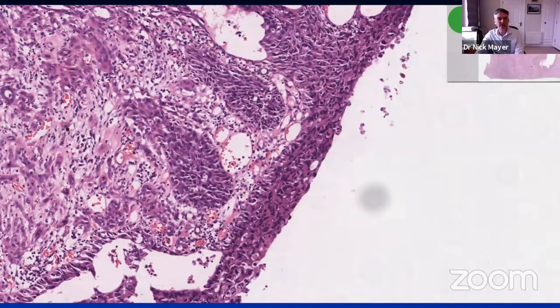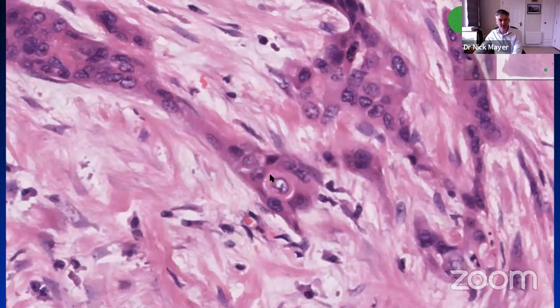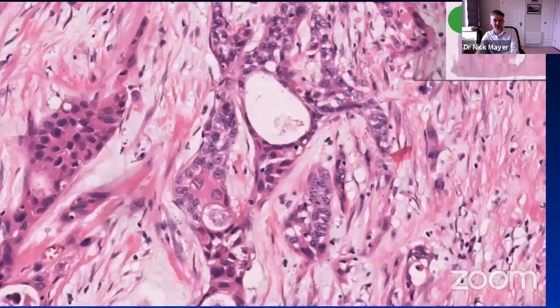And this is a fairly representative view of the invasive tumor, which was quite solid and nested, and you got the impression that it was trying to keratinize in areas, and there were a few nice dyskeratotic cells with a few intercellular bridges or prickles. So the suggestion that there was squamous, or at least squamoid differentiation, and there were some gland-like spaces as well, where pseudoglandular is certainly possible.